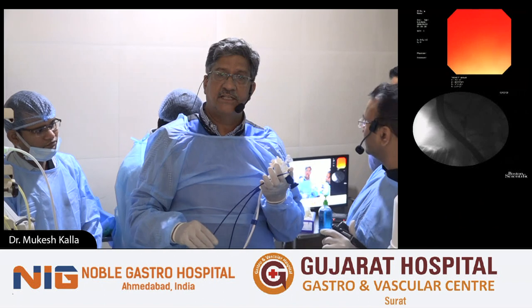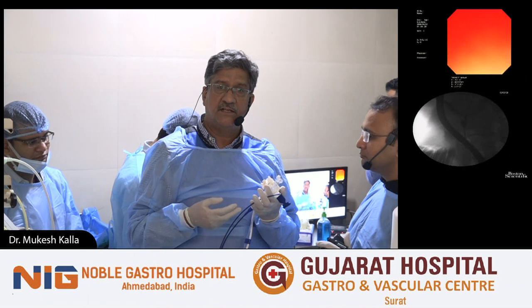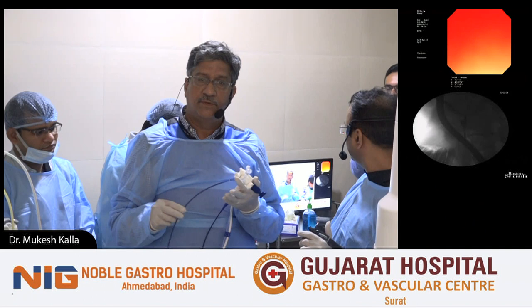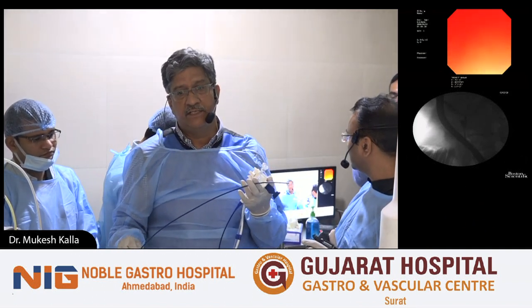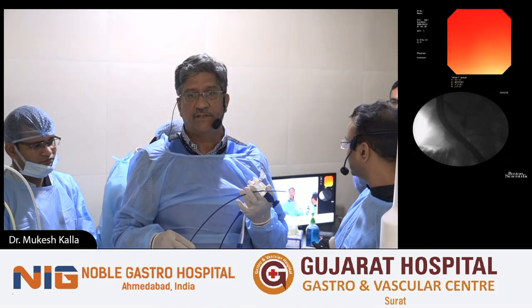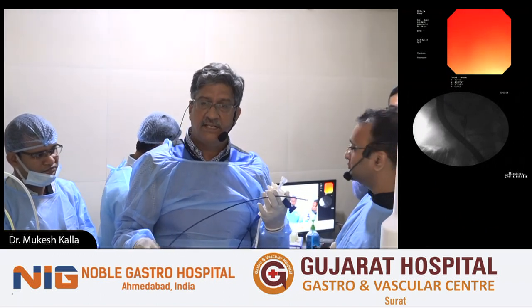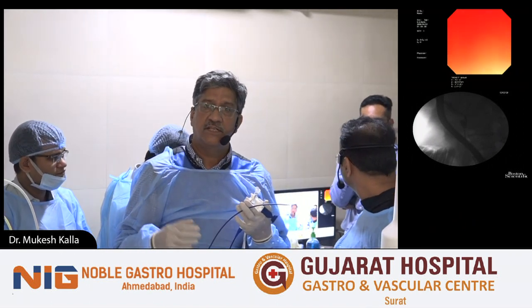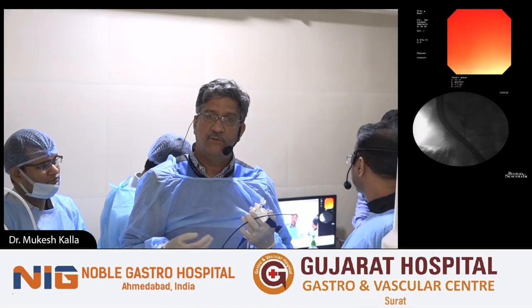The learning curve on this equipment is not great. Anybody who is well versed with ERCP can easily start doing a cholangioscopy procedure. The aim here is to understand this scope very carefully, because this is an expensive technology, and if we are careful and can use it 4-5 times, then it becomes a cost-effective procedure. You will all appreciate that a CBD exploration in any of these setups would probably cost 50-60,000 rupees, at least in Rajasthan. Gujarat is a rich state. For the same charges, without cutting open the abdomen, we can retrieve most of the stones possible.